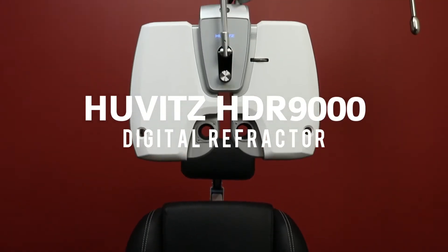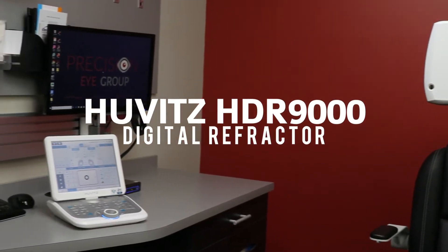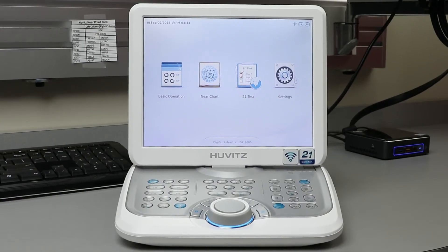The Huvitz HDR9000 Digital Refractor with a 3-year warranty from Norwood Device and Diagnostics. The Huvitz HDR9000 is a feature-rich digital refractor with a user-friendly interface.